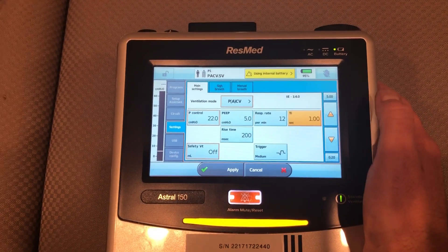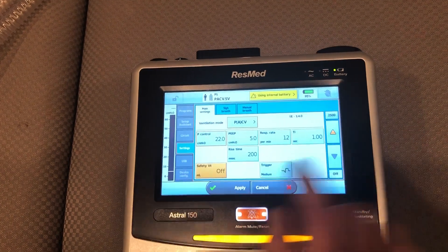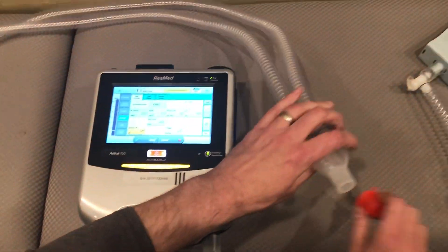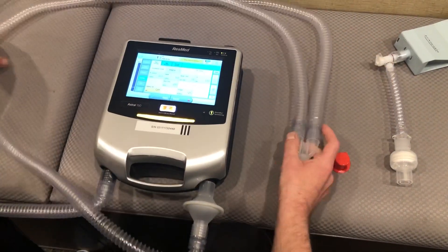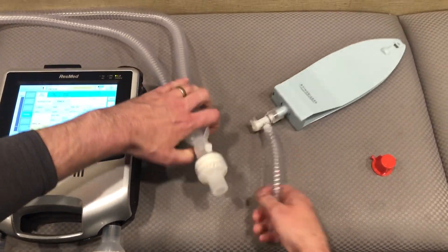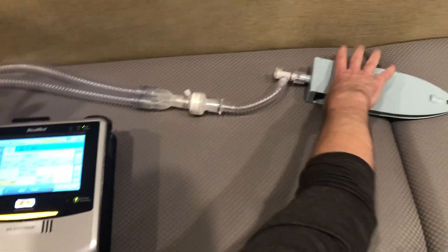I'm going to leave my I-time at one and my safety tidal volume I will leave off currently. Now I want to set up my patient. You can see we've got our dual limb circuit, our HME, our trach adapter, and our test lung.